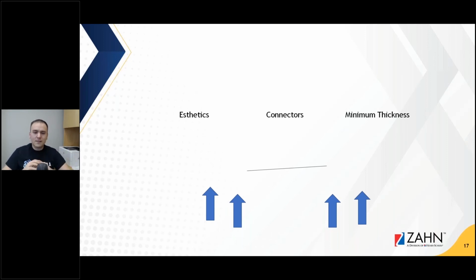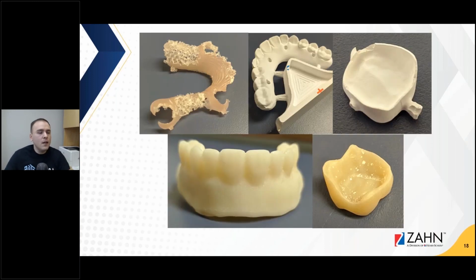So these are the things that I believe are important, the little details that need to be ironed out, and to see if your design center can actually deliver on those. Then we have an example of great designs, but poor manufacturing. Thankfully, here at Aurora, we try to do our best to manufacture things at higher volumes, honestly, but also at great quality. And we spend a lot of time on quality control. And when things don't work out because they weren't made right, we suffer.